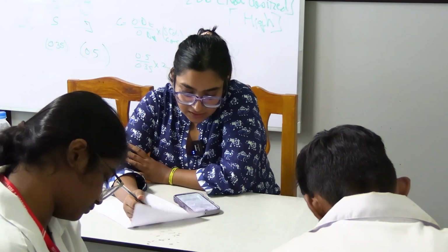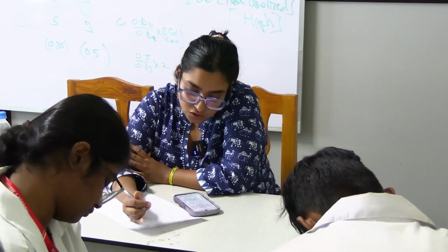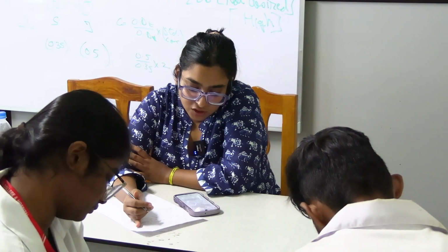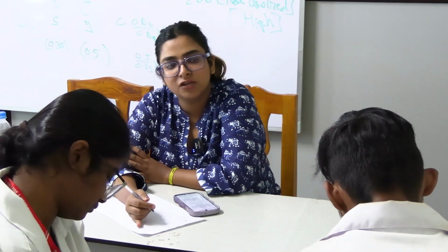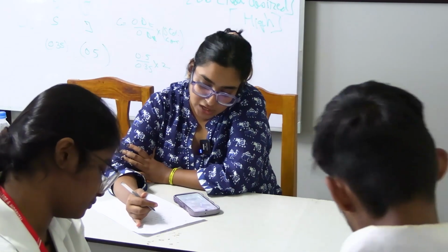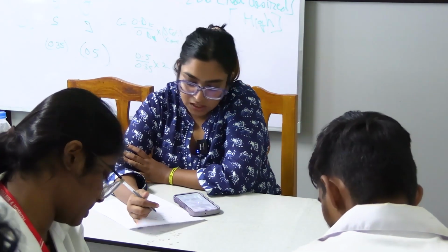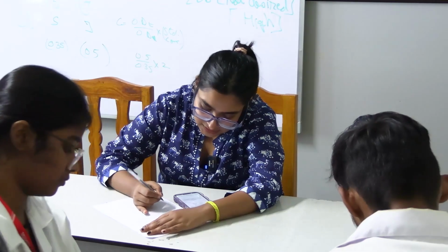History reveals he had several anti-anxiety medications and also had anxiety attacks before while being worked up for chest pain, and ABG is done. So this person was on anti-anxiety medications. He does not have any systemic illness, and this person is running out of breath and he has shallow and rapid breathing. He is hyperventilating, that means he has rapid breathing, and one ABG was done. Okay. What does this ABG show?